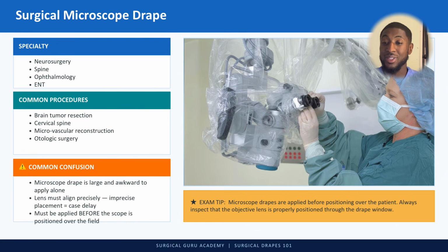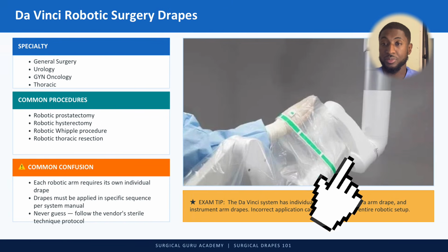Lens must align precisely. Imprecise placement will equal a case delay. And it must be applied before the scope is positioned over the field, obviously. You don't want contamination.